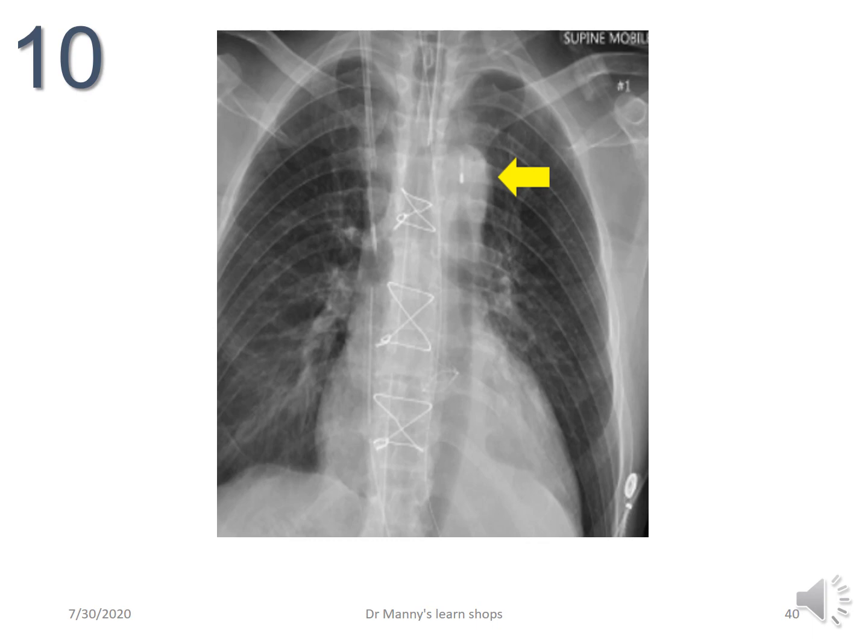So, the endotracheal tube seems to be okay. It's placed, we said, medial to the clavicles as a rule of thumb. The central venous catheter seems to be level with the carina, T4, cavo-atrial junction.